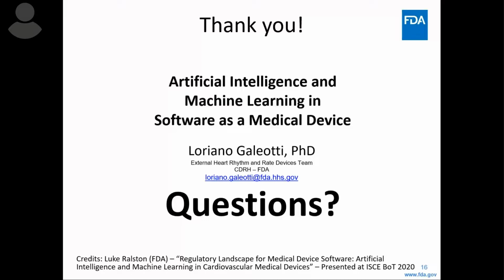It is quite possible and quite commonly done to leverage additional information about what's inside, how you trained, and what this device is looking at to reduce the burden of validation. So instead of having millions of ECGs to validate, you may validate with less. Yep. Okay.